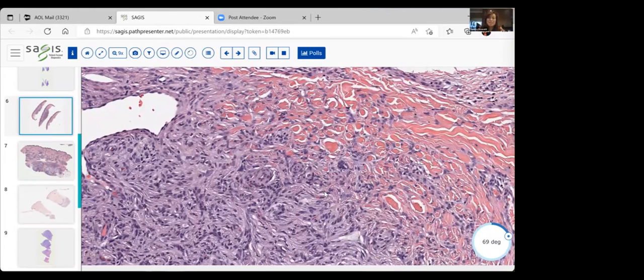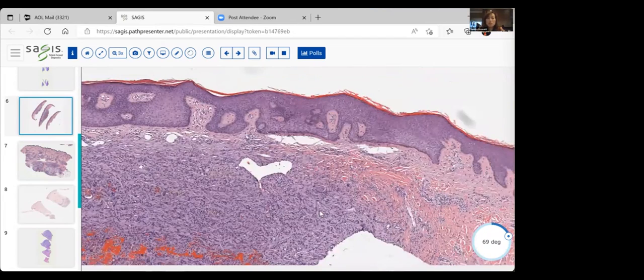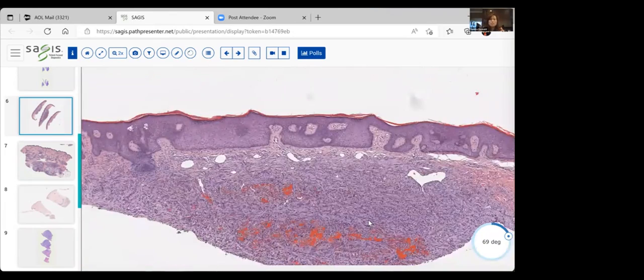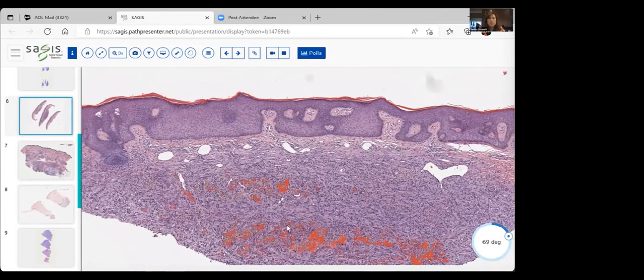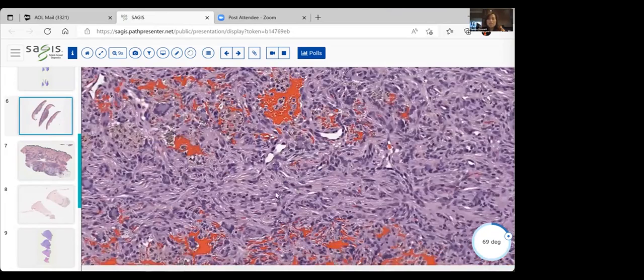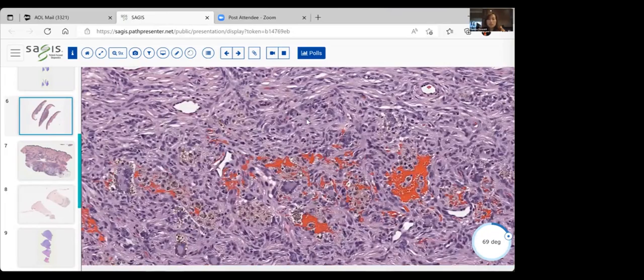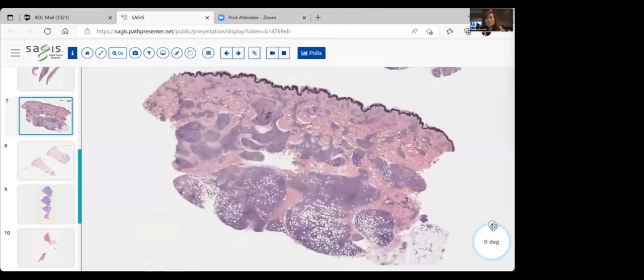I think this is a great example of an aneurysmal type dermatofibroma, demonstrating the large cells, which we call the ringed lipidized siderophages. And I have seen on board exams a close-up, for instance, of this ringed lipidized siderophage, and they show you this spindled or plump spindled cell population and ask you what the diagnosis is, and you can say that is an aneurysmal type of dermatofibroma. Let's go to 7. All right, this is another great example.